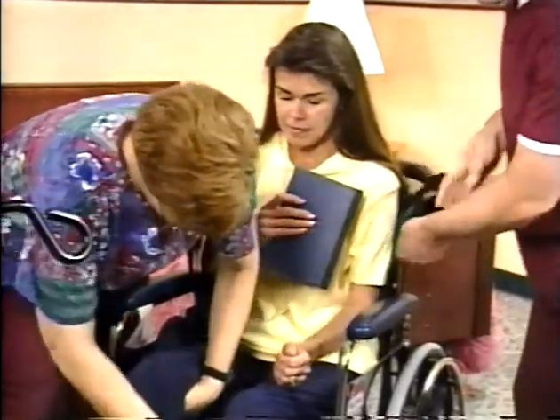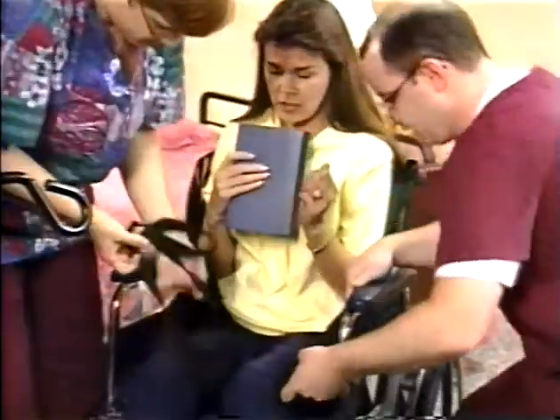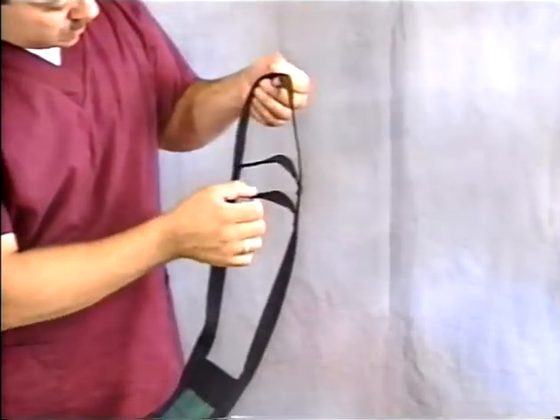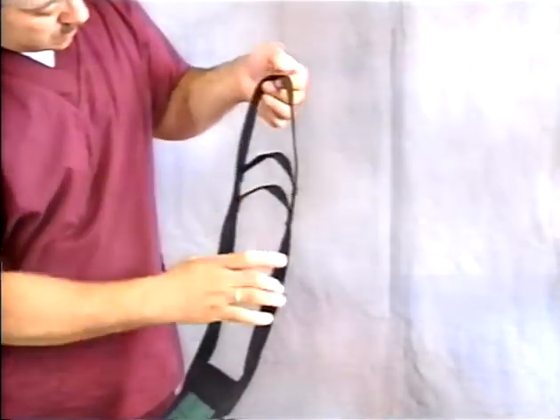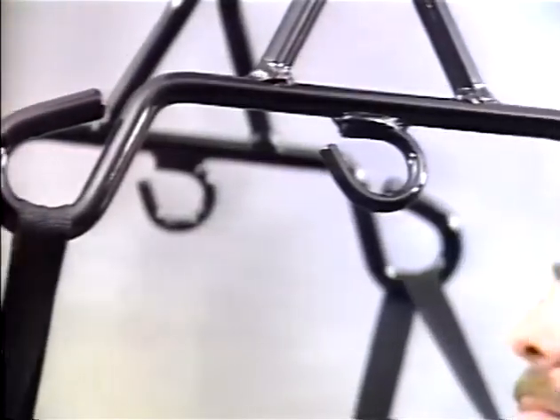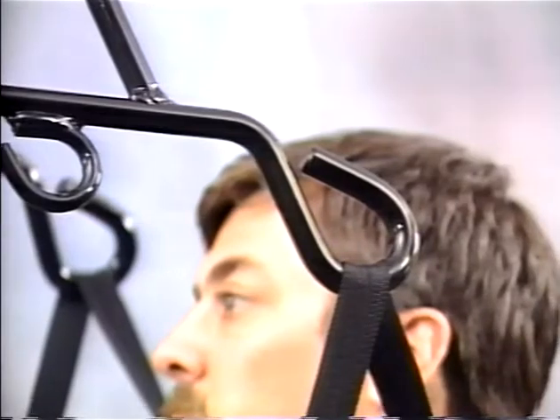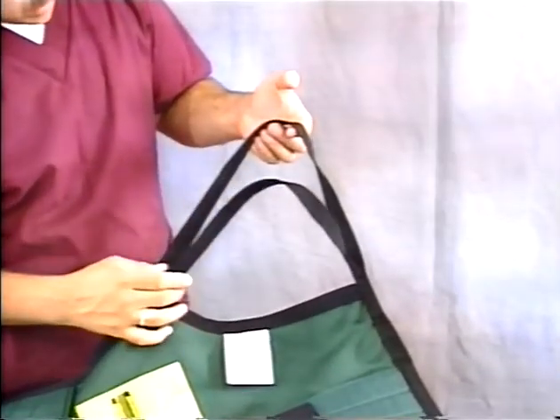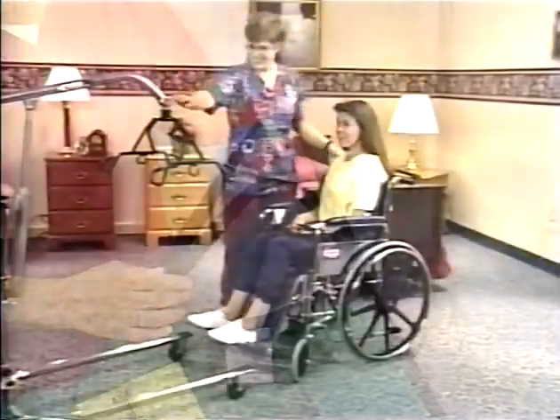Cross the loops through the big opening. Attach the leg strap loops to the front cradle hooks. Use the bottom loop for standard positioning, the middle and upper loops for increased leg flexion. Attach the shoulder straps to the two back cradle hooks. Use the shorter loop for an upright position and the longer loops for a reclining position.